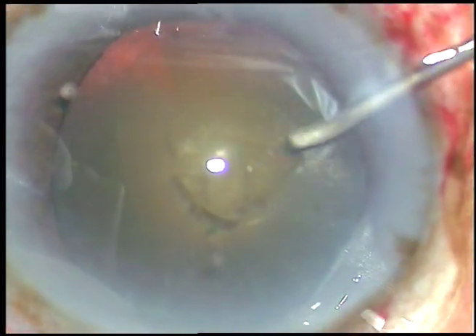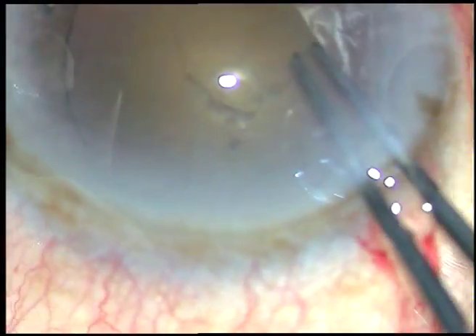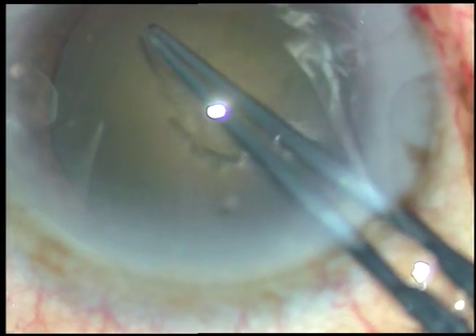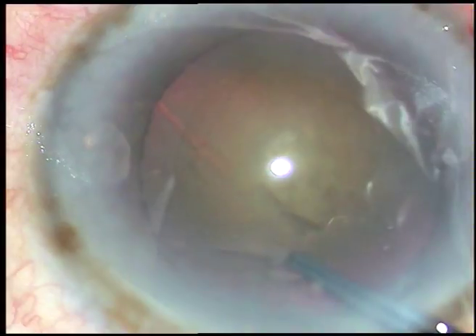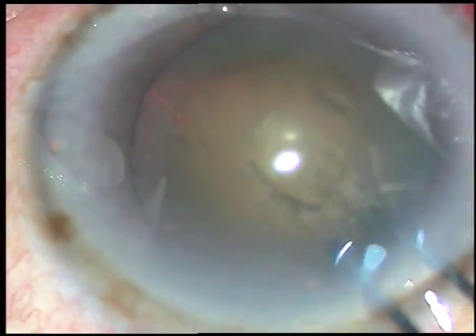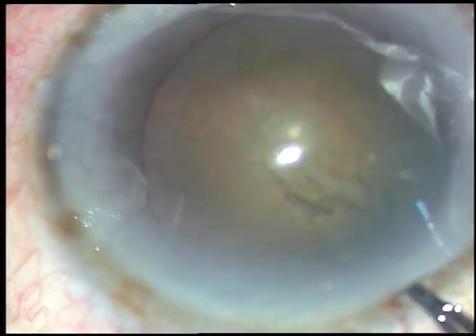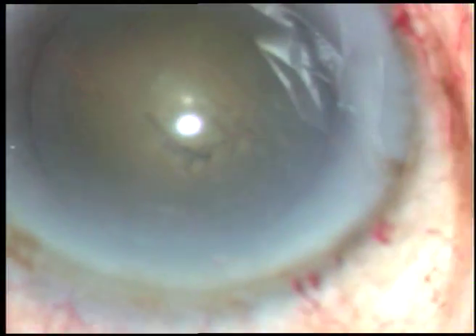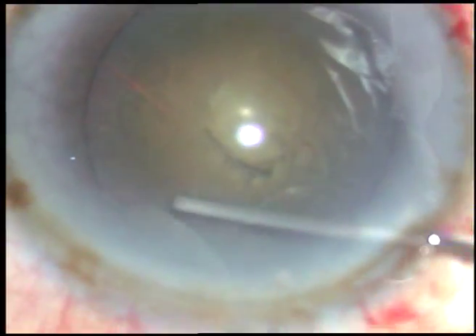Viscoelastic substance has been spread over the corneal epithelium for better visibility and it also protects the corneal endothelium quite well. The capsular tag has been raised. Hold this capsular tag with Utrata forceps, go anti-clockwise, try to remain at equal distance all around from the border of the pupil, and make an adequate sized rhexis. In this case the capsulorhexis size has been on the smaller side, about 5 millimeters or so.